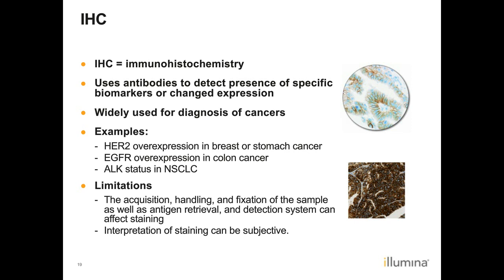IHC is a technique that is very well established, it's cheap, relatively simple. However, it's not without limitation. The acquisition, handling, and fixation of the sample, as well as antigen retrieval and detection system, can affect staining. Moreover, the interpretation of staining can be quite subjective.